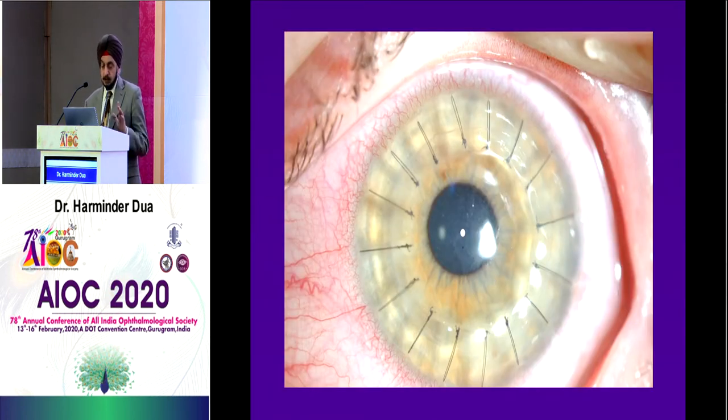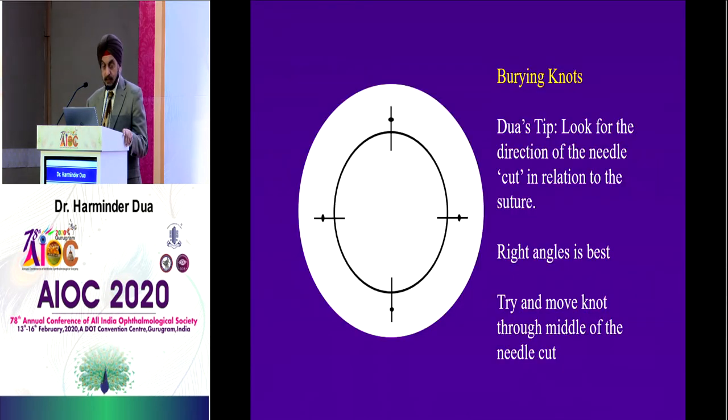This is in the context of corneal grafts: the suture should be radial. Now look at this suture here, look at this one, and look at this one going a different direction. When that's the case, then you know you've not placed them right. They should all be radial.